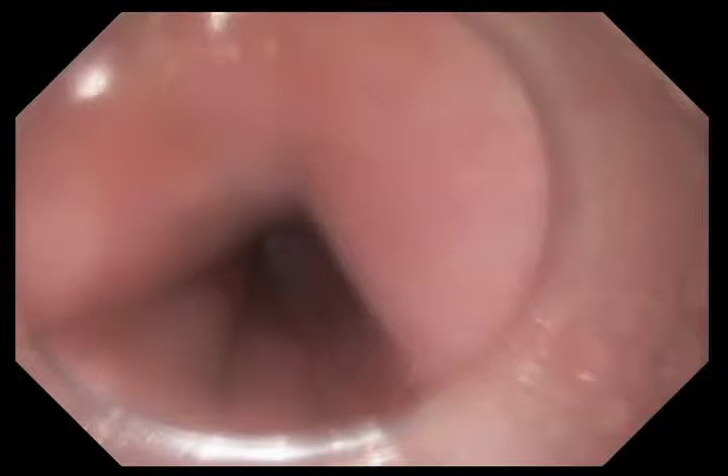We're going to show a video sequence demonstrating the use of a device called the HALO-90 radiofrequency ablation device. This is a device that delivers radiofrequency energy to a specific depth and is used for doing what I call touch-up jobs with Barrett's esophagus. So if there are residual islands of Barrett's that are present, we use this device to treat those areas.